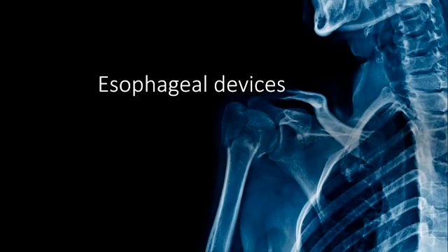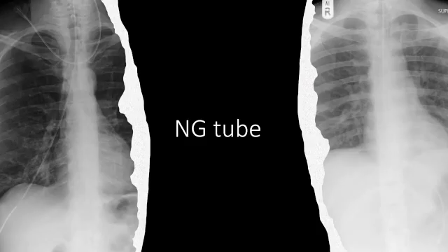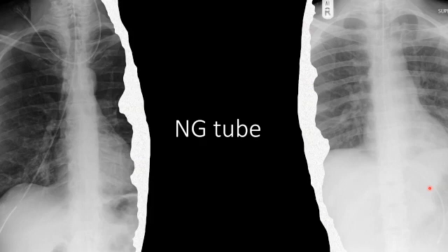In the next few images we're going to look at the placement of esophageal devices. This first image shows a nasogastric tube in satisfactory position within the stomach. Nasogastric tubes typically have a side hole where there is a break on the radiopaque marker, so you can clearly see where it is. That side hole needs to be below the diaphragm, and ideally you want the tip to be at least 10 centimeters below the diaphragm.